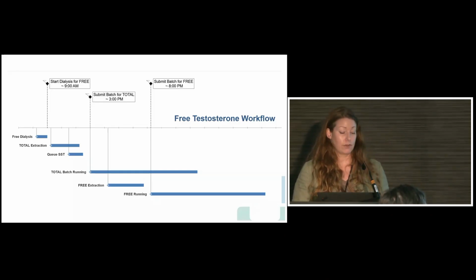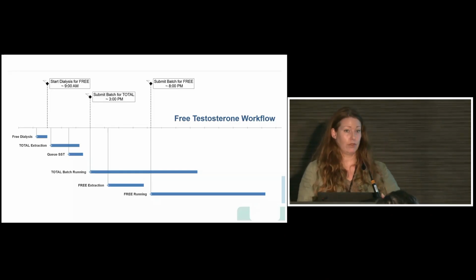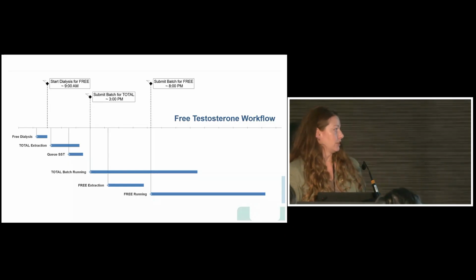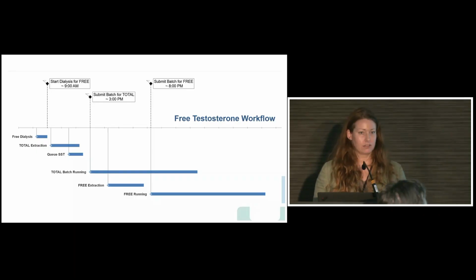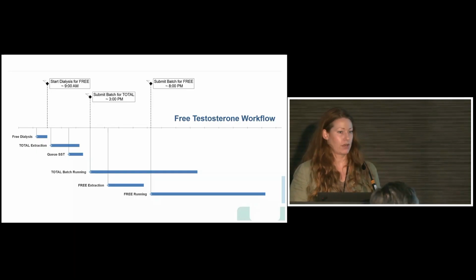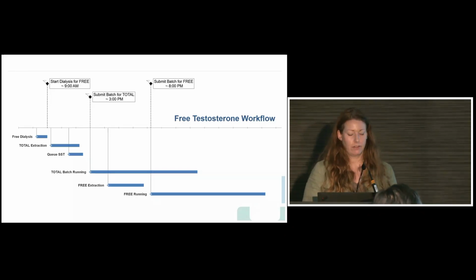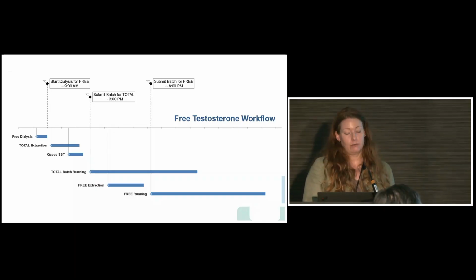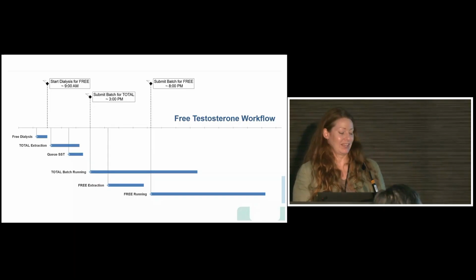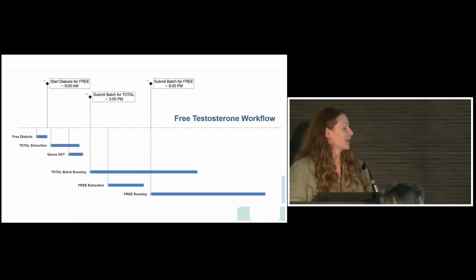So first shift will ultimately build the batches. They're going to start the dialysis, then they'll be able to start their total extraction. And the extraction time total, once you aliquot, is probably around an hour, hour and a half, so that's pretty quick for the clinical lab. While they're drying down, and we nailed this down during training, I'm like, this is what we're doing, this is how this is going to work.